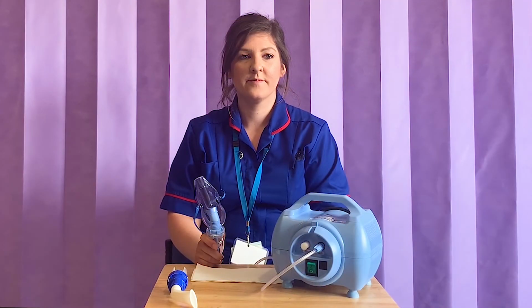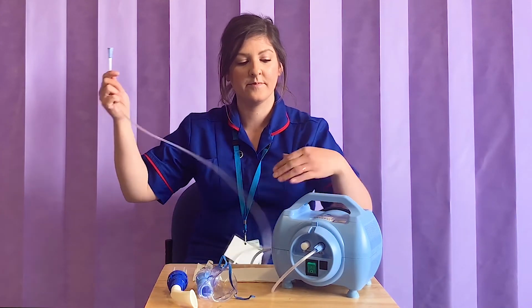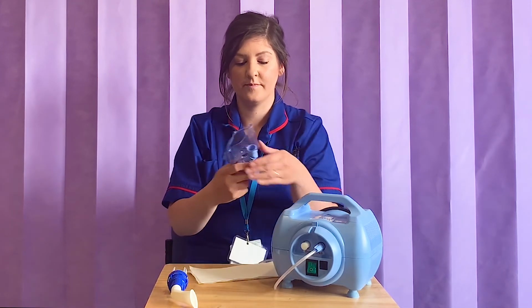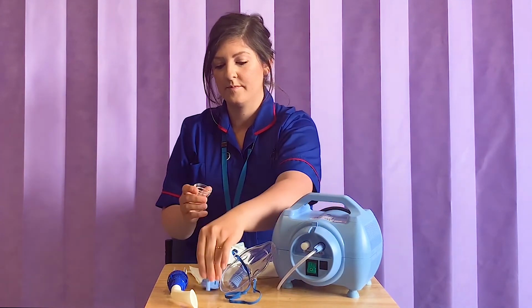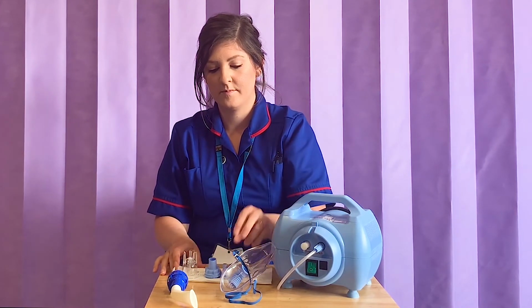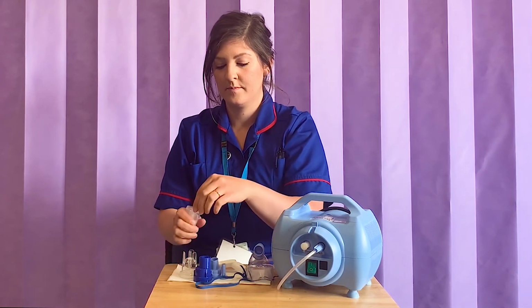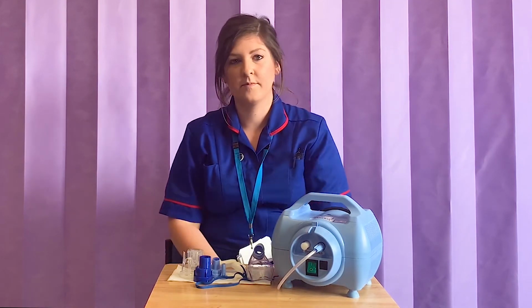After each use, disconnect the mask or mouthpiece and chamber. Turn on the compressor for a short time to clear any moisture solution from the tubing. Wash the individual parts in warm soapy water. Rinse under hot running water to clear fine jet holes and leave to drain in a dry place, on top of kitchen roll in a small plastic container. It is essential that all parts of the nebuliser are completely dry before you put back together. Wipe over the machine weekly with a damp cloth, unplugging the machine before you do this.